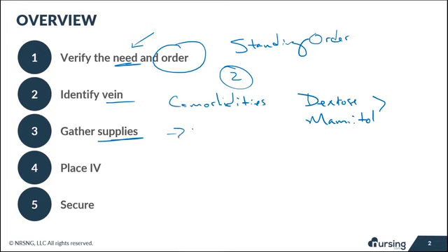The other thing that you're going to want to do is set up, and you're going to see this video here in just a minute. We'll go over how you set it up and how you get everything ready and available for you to reach over and grab whatever you need. This is a really important step right here. Next thing you're going to do is placing the IV. We have lots of videos on the nuances of different types of patients that you may run into, different types of locations, and I want you to refer back to those videos. But for this, just think about, hey, I'm going to go in there, I'm going to knock this out, I'm going to get this IV placed, and I'm not going to worry about it anymore.